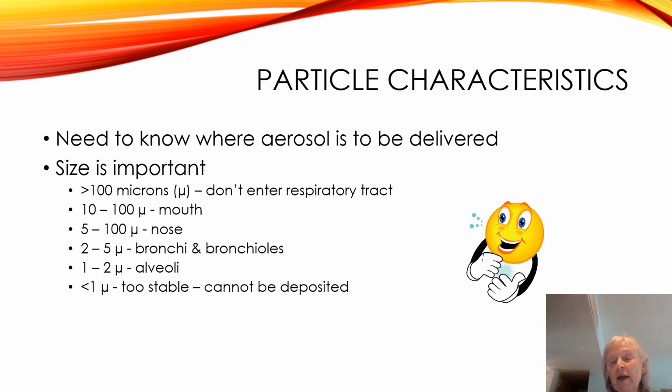So what we look at is the mean particle size, and then we look for the distribution of those particles. If 85% of them are in the center, then that basically means that 85% of the particles are somewhere less than or greater than 3 microns. Then we can look out at the standard deviations and see how many particles fall into these standard deviations. And that tells us how many particles are going to be effective for us.